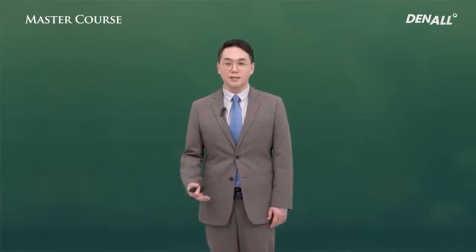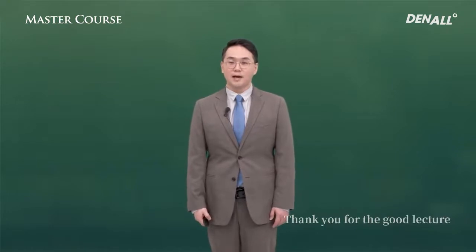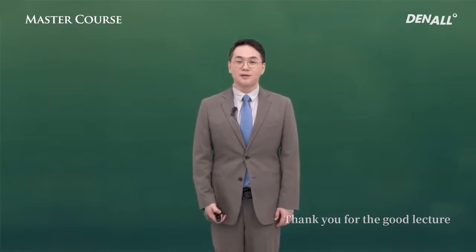So autogenous bone graft can be the first choice if it gives less discomfort to the patient and less burdensome to the surgeon. So the autobone collector is very useful in that respect.